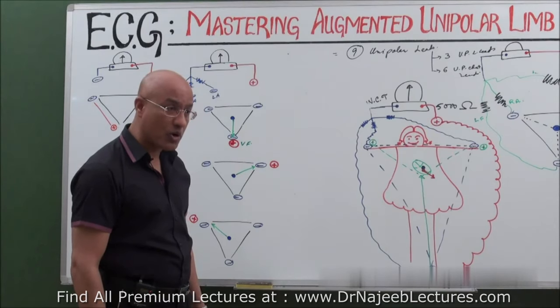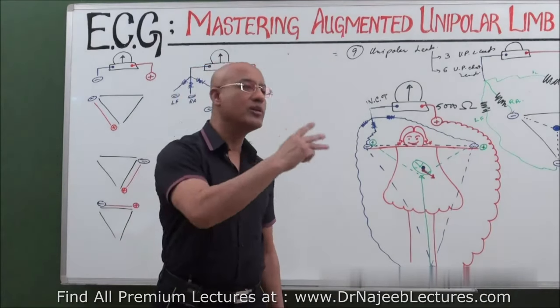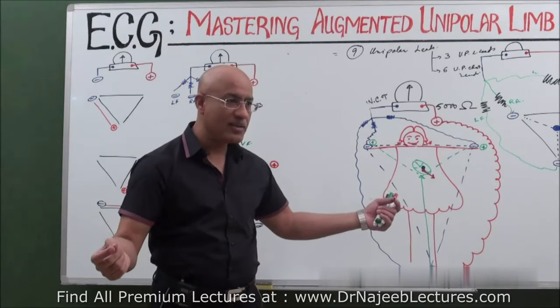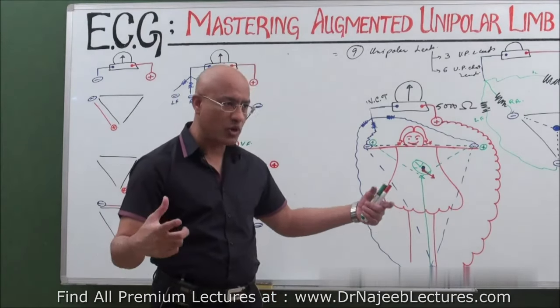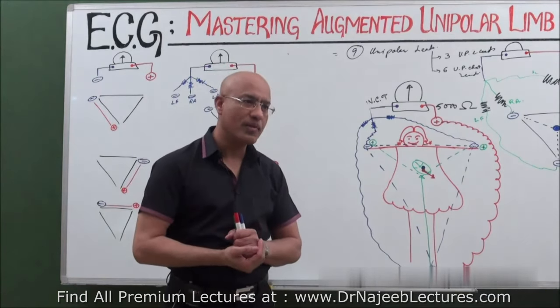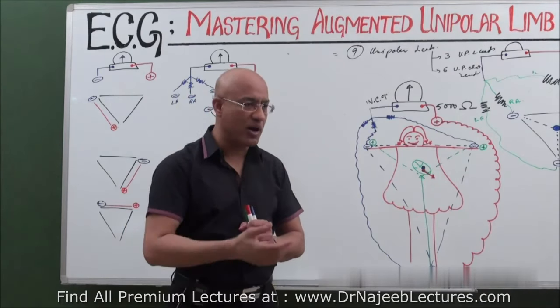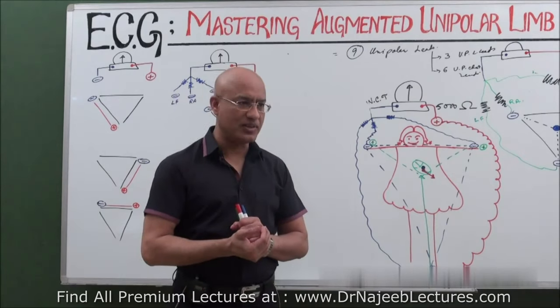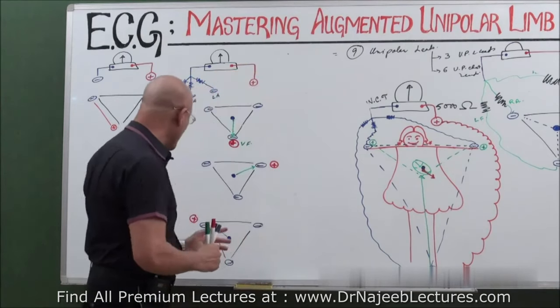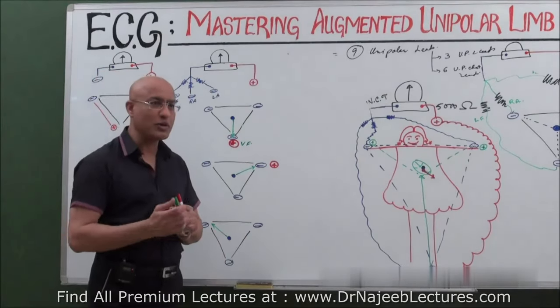Even though he was able to look at the electrical activity of the heart with three more new leads, and he made three new leads without applying a new electrode, using Einthoven's electrodes, the issue was that the voltages recorded were very small. Then in the 1940s, a more naughty doctor came. He wanted to look from here, but with a magnifying glass. He wanted to augment the voltage.